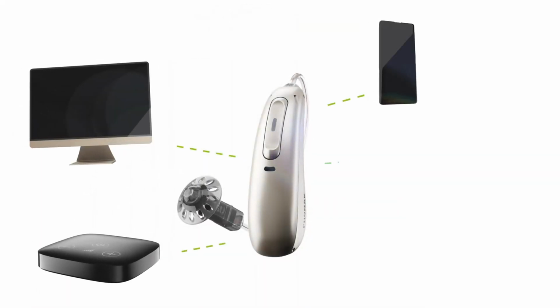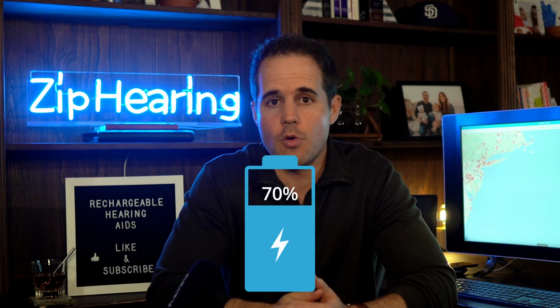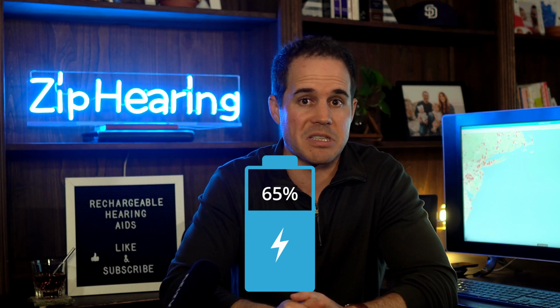For the downsides, first, you've got to remember to charge it daily. And that is a deal breaker for a lot of people who don't want to feel tethered or tied to their charger. The other downside is if you wear your hearing aids 16 plus hours a day, and if you're using some of the Bluetooth features like making calls through your hearing aids or streaming music, these things can drain batteries quicker, and you may sometimes only get 12, 14 hours of battery life each day. Initially, you're going to get that 16 plus hours out of them, some much more. But by year 2 or 3, there's a real chance that that number is down to 10, 11, 12 hours a day. So that is a real risk.